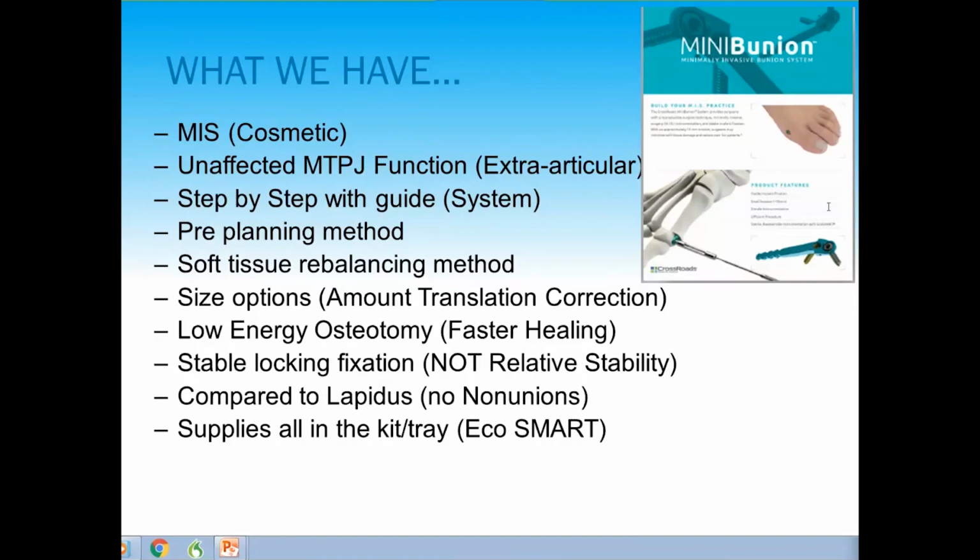So the question came in about translation. The level of the osteotomy, since I showed that one x-ray that I went more proximal, would you have to translate less if you went more proximal? And yes, that is true. As you go more proximal towards the CORA or the apex, you don't need to laterally translate as far if your osteotomy level is closer to the Lisfranc joint rather than further down by the head of the first metatarsal.